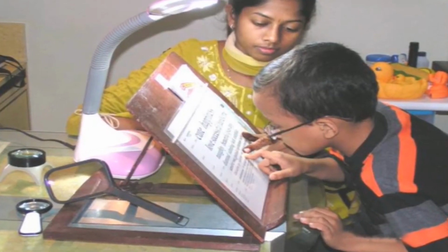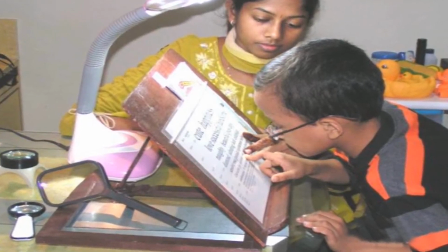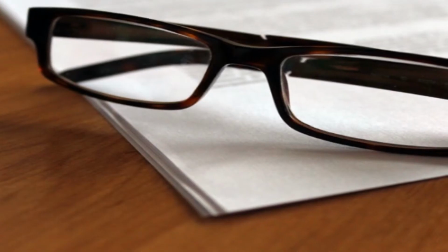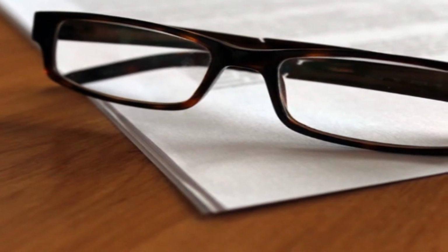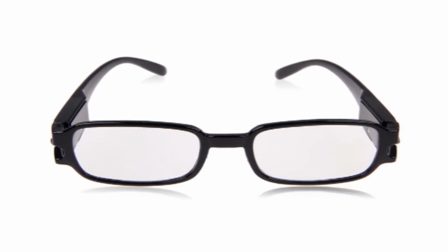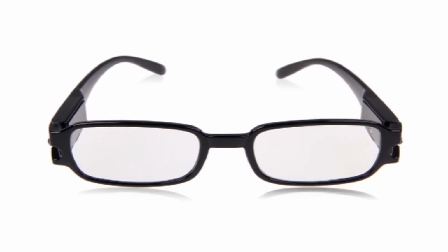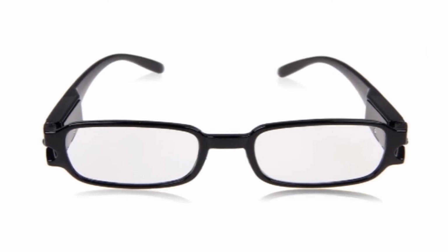Spectacle magnifier. Spectacle magnifier will not be useful for the children as the working distance is close to the eye. It is not useful for prolonged reading as it has closer working distance due to the higher power. When using spectacle magnifier, the reading material is first placed at the focus distance as advised by the professional, and the same distance is always maintained.